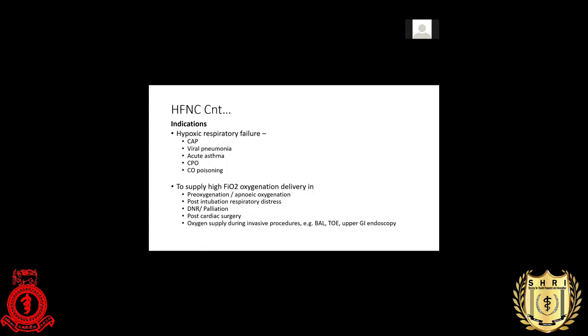And when we are managing a patient where we have decided not to do active resuscitation, then we can give high flow nasal oxygenation as a palliative therapy. And also post cardiac surgery, and during some interventions like bronchial lavage, TOE, upper GI endoscopy, to supply high flow. All right.